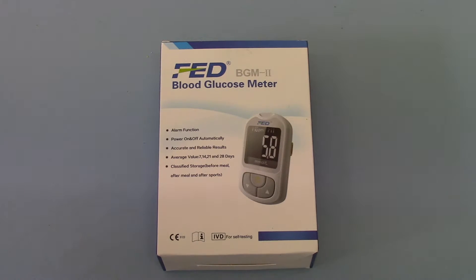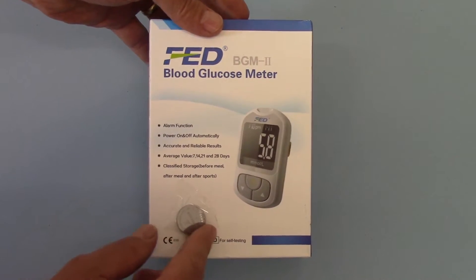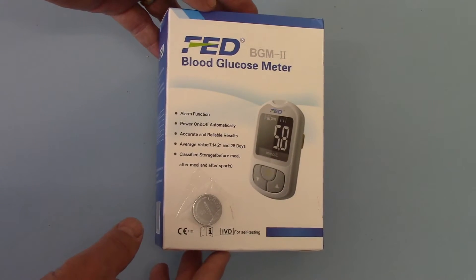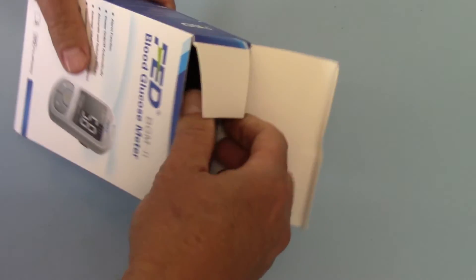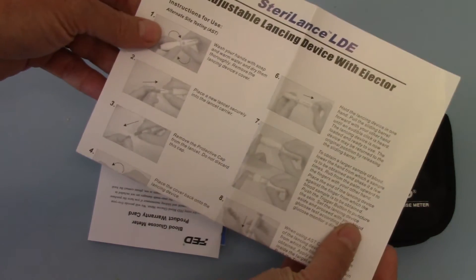So in part one we're going to run through the box pack — the full pack. The packaging is what you see in front of you. The FED BGM 2 meter comes in this box pack, which is the CE 0123 packaging. The battery is usually packaged on the outer aspect, as it is an additional add-on item that wasn't packaged with the packs from the manufacturer. So when you buy from Access Diagnostics you will get a separate CR2032 battery on the outer. Opening this up to demonstrate what's inside, you get a guide to the SteriLance Auto Lancer with ejector, which comes with the unit.